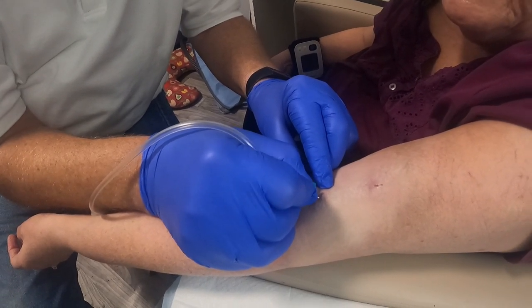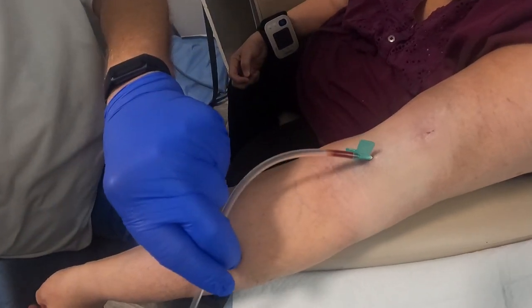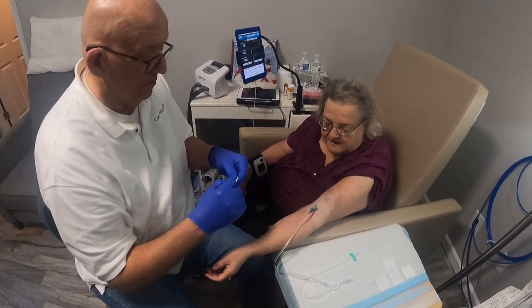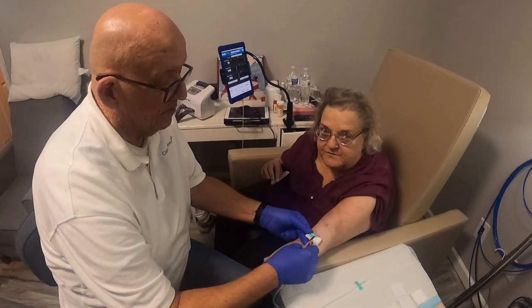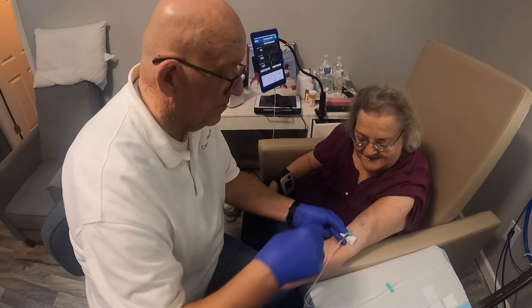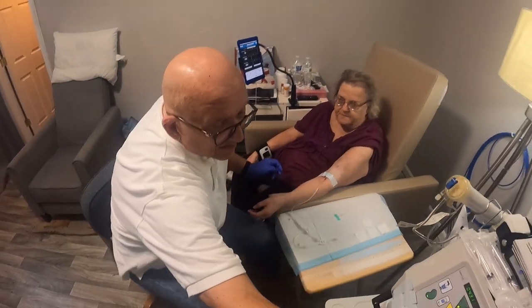And usually once he gets in there, he can kind of feel it. It'll kind of take the needle. And he feels it, and he goes all the way into the hilt on the needle. And then you can see it pulsing. When you initially hit it, it's called the flash, which most anybody that's had their blood drawn has probably heard that term. But the important thing is that it keeps pumping. If it's stopped, that means we've either run into the wall of the artery, or we've got a clot. So that's why we have to make sure it's still moving when we put it in there. One down.